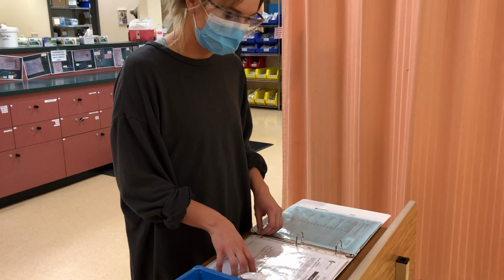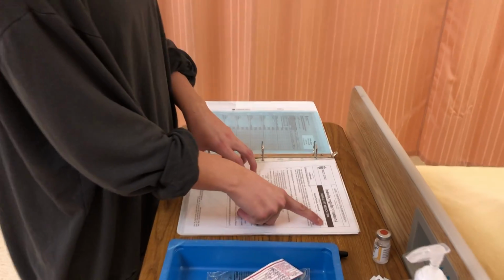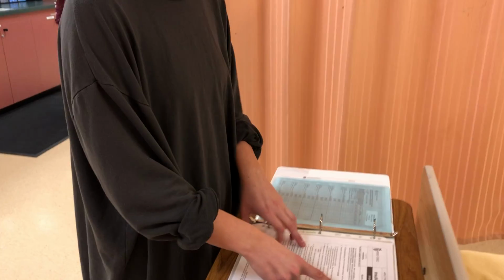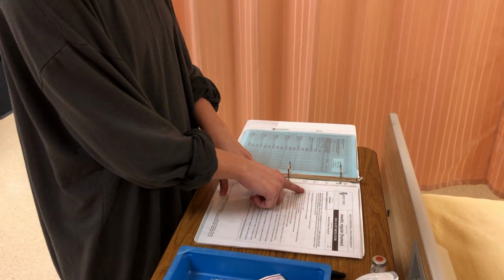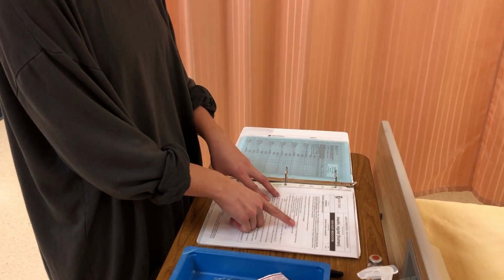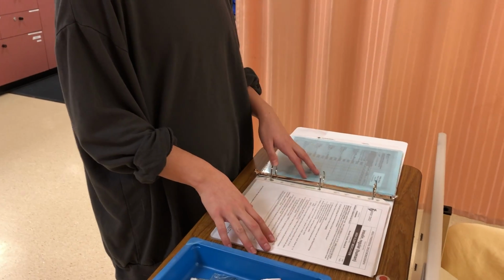I'm going to go over the PDM. So we have insulin, Humulin R. It's a high alert medication, anti-diabetic. Since it's a high alert medication, we're going to need an independent second check by a nurse. It can be administered by a nurse or student nurse. We've gone over the physician's order for the infusion, and we know our rate, we know our frequency of blood glucose monitoring.